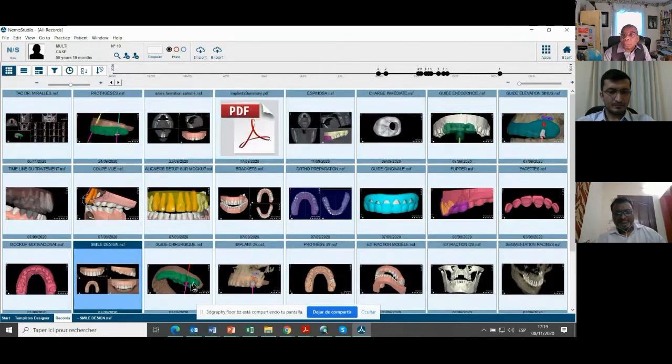It's very simple in this case, one single implant, but I can do full-arch cases, All-on-6, All-on-10. I mean, many possibilities, of course. We can also create other products like endodontic guides, or guides to do a guided sinus elevation, or a guide for cutting, a bone reduction guide.